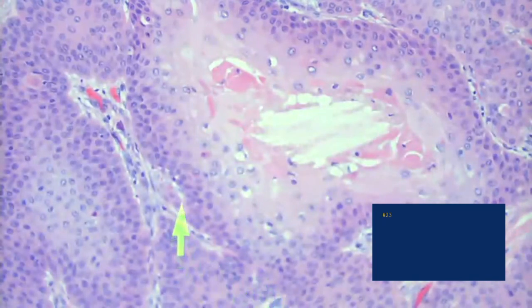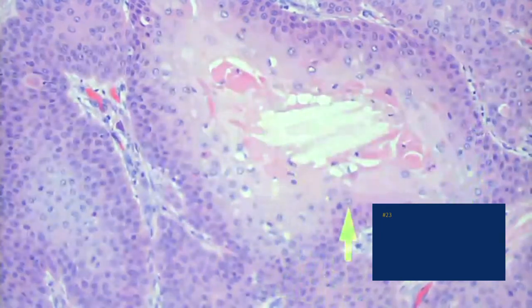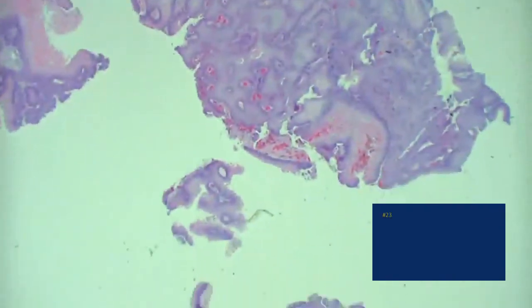It has multiple names. If you just had this one little area, it looks like a little cyst, an isthmus-catagen cyst. So you'd say that's probably the basic building block of the entire region. If you go back to lower power, you see there are tons of those little cyst-like structures with all the pseudoepitheliomatous hyperplasia associated with it. It's not true epithelioma, it's pseudoepithelioma. And these are the rolls and scrolls areas. I haven't heard that term before, but that would fit, if you want to use that.